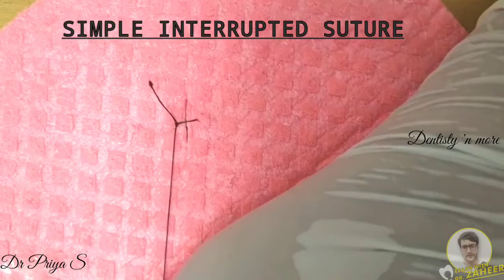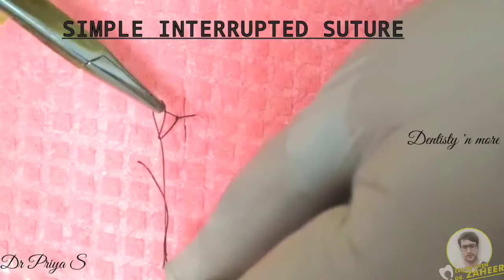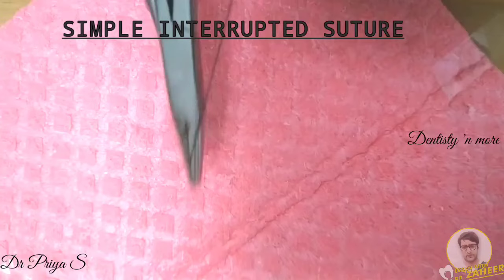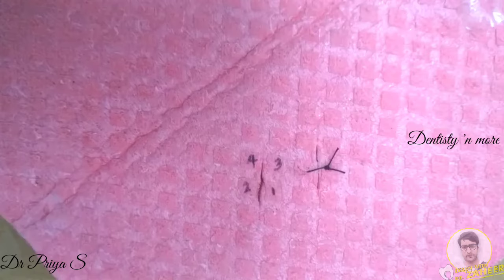After this, make one more loop of the suture around the needle holder in the opposite direction to that of the first two loops. Again, grasp the tail end of the suture and pull it through to complete the surgeon's knot. Now hold both ends of the suture material and cut the ends keeping suture tags of 4 to 5 mm. So here is your completed simple interrupted suture.